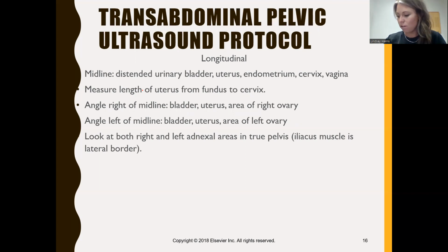So we're going to go to the right ovary here, and we're going to do a long measurement of the right ovary. We're going to evaluate the right ovary to make sure there's no masses, cysts, anything going on. So we'll do a length, an AP diameter, and we will put some color on the ovary to make sure that there's vascular flow because it's very important.